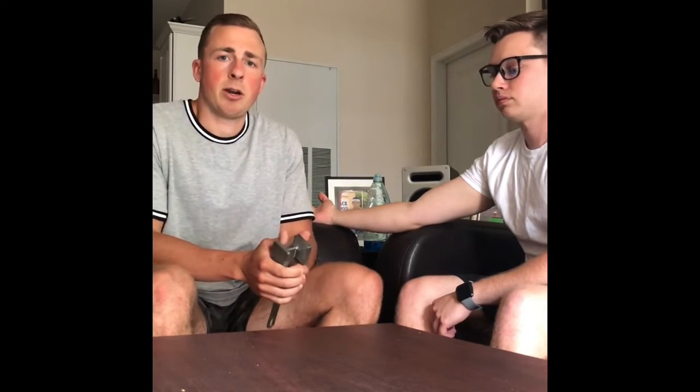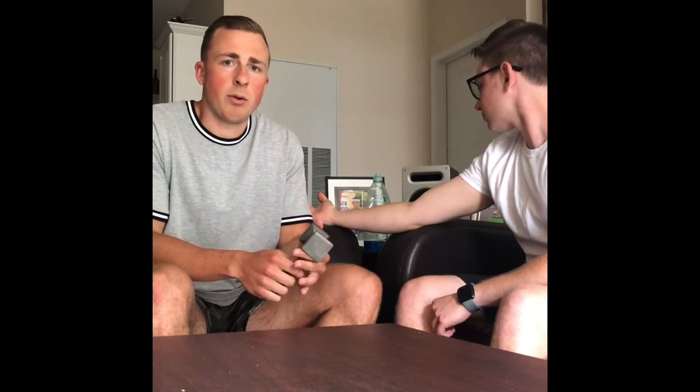So what we're going to do first is we would set the parameters, like I said earlier, around 3 megahertz, anywhere from 0.5 to about 0.8 watts per centimeter squared. We definitely want to use a pulse setting at 20%, and then we want to do the treatment for around 6 to 10 minutes.